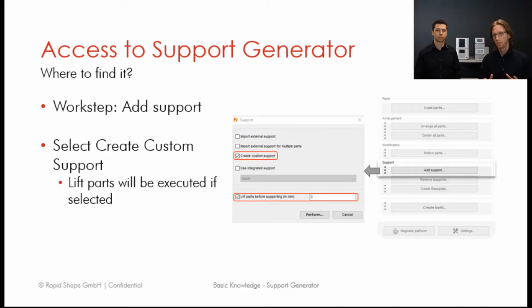When you do this, please be aware of the fact that you still have to create a certain gap between the part and the platform. So please allow 3 millimeters as a gap between those, because otherwise not all settings from the support will apply. More than 3 millimeters is not necessary, you just want to save time. Less than that would be a little bit critical, because not all settings of the support script will apply to your part. All right, so this is where to find it. I think this is pretty straightforward. This is just 2-3 clicks from the main machine environment.